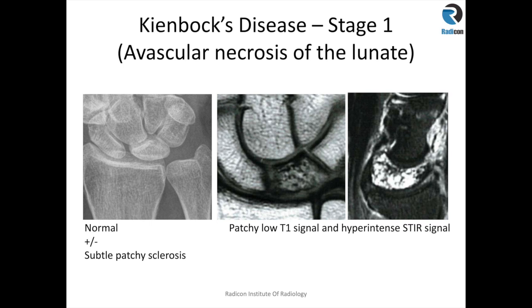The main osseous pathology, or one of the osseous pathologies you might come across, is Kienböck's disease, which is avascular necrosis of the lunate. There are different grades of it. You can either try to remember the grades and describe them, or just describe what the findings are. In stage 1, the height or shape of the lunate remains the same, but you get wrist pain. On MRI, you see patchy low T1 signal and hyperintense STIR signal changes in the lunate, pointing towards early Kienböck's disease.